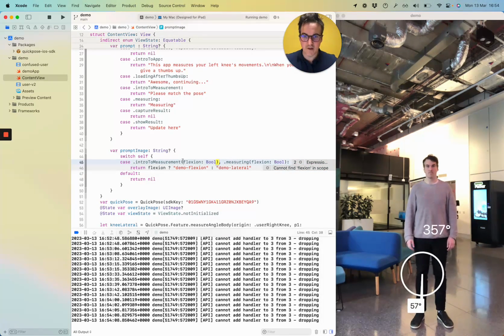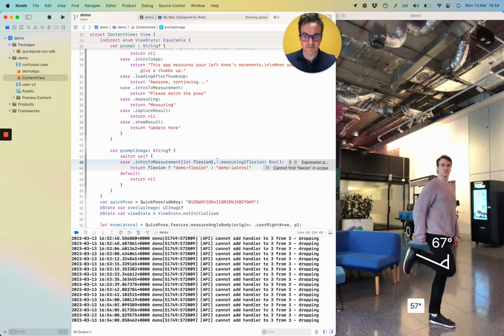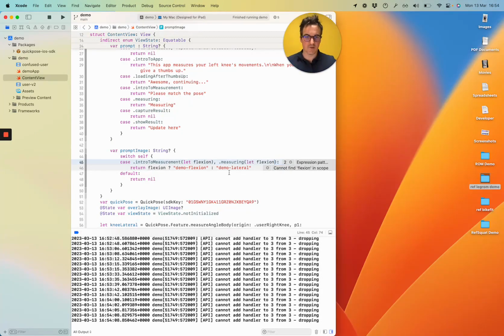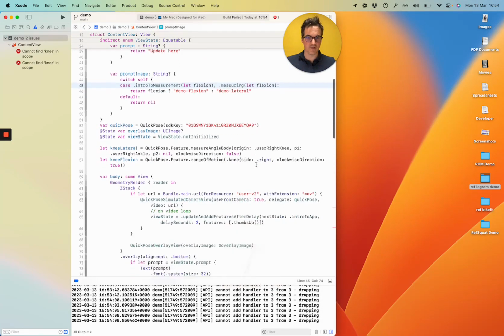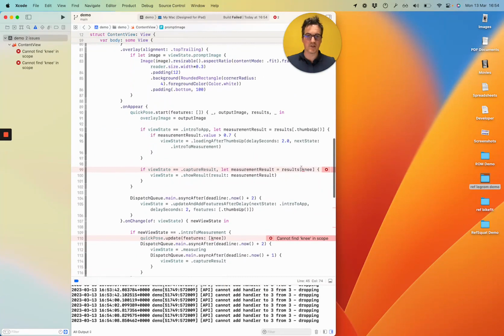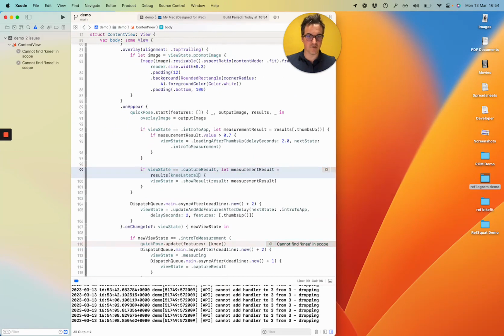Oh no, they're let values. Right, let's see what this does. I cannot find knee in scope. Oh yes, because now there's two different types of knee results. First one is knee lateral, and the other one is knee flexion. So I'm going to put our check here if it's knee flexion or knee lateral.